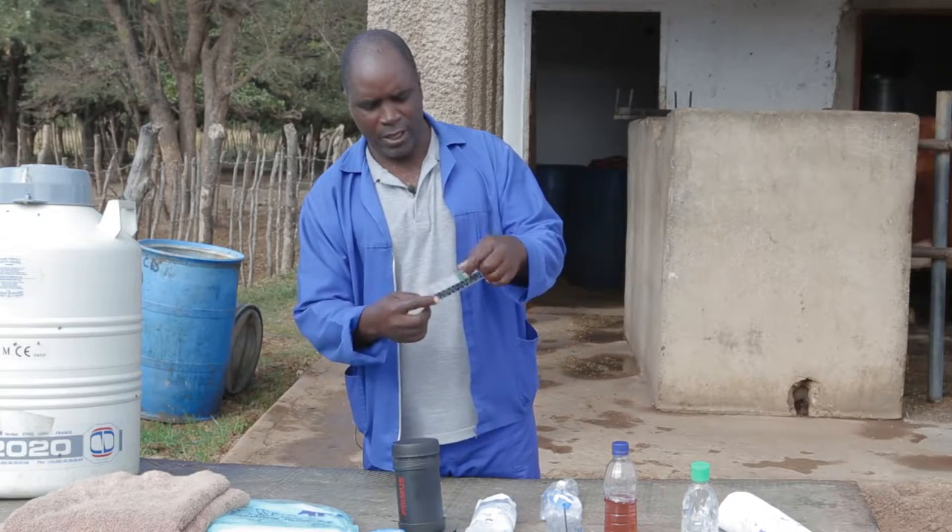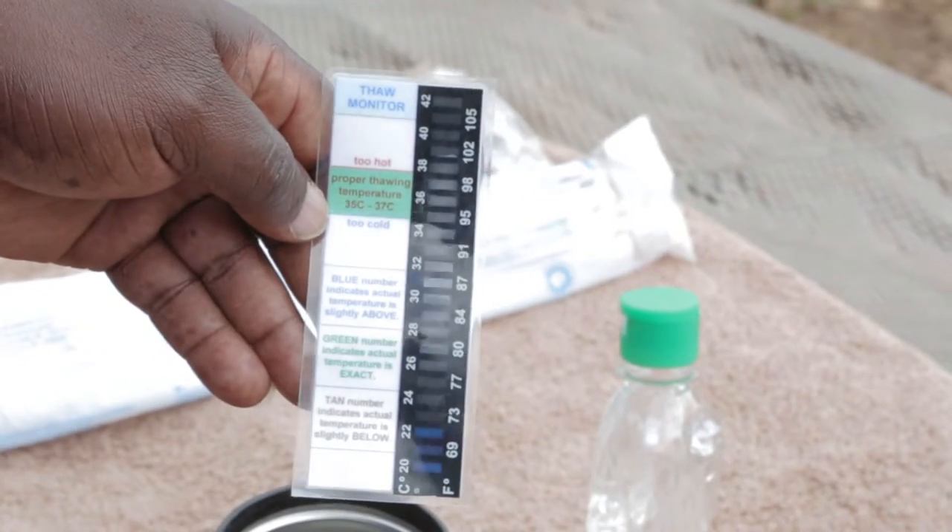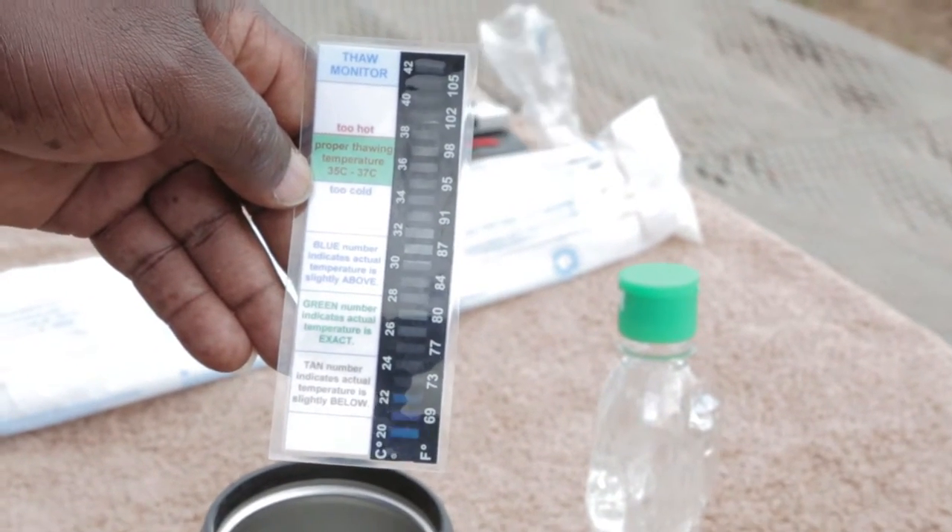And this is a thaw monitor. It is used to check the temperature of the water so that you see the actual temperature that you need to thaw the semen at.